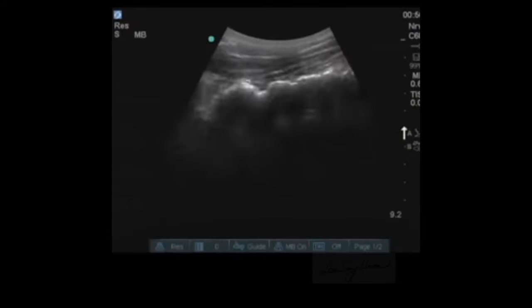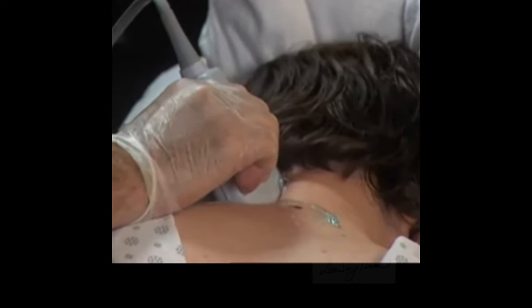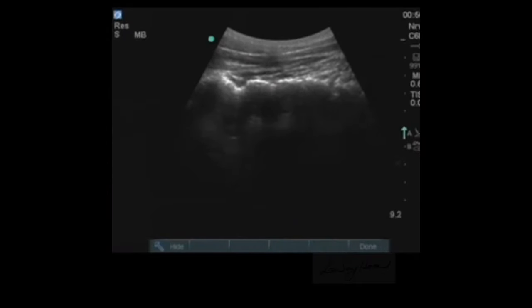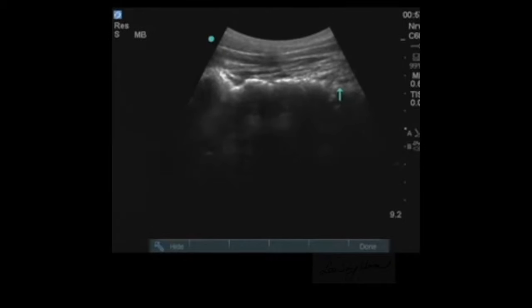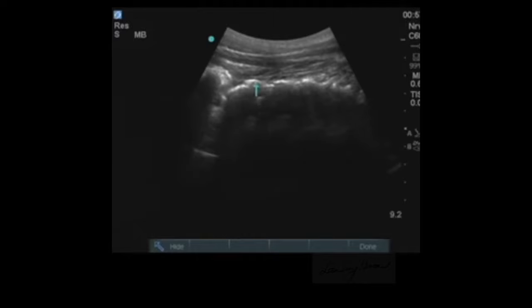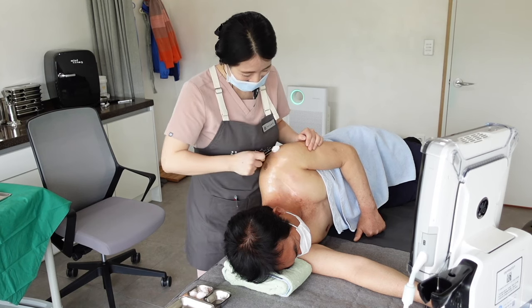Please watch the video I captured from a famous YouTube channel — it's about the cervical facet joint ultrasound scan. He chose a convex probe and intends to use an out-of-plane technique. However, I believe the lateral neck is a narrow space to accommodate a sizable convex probe, and inserting the needle will be awkward. So I prefer a linear probe and in-plane technique. I share my technique from the basics.